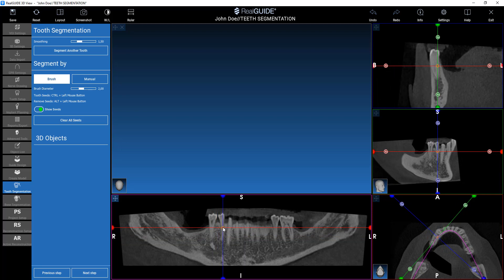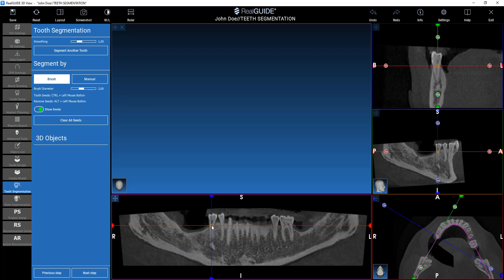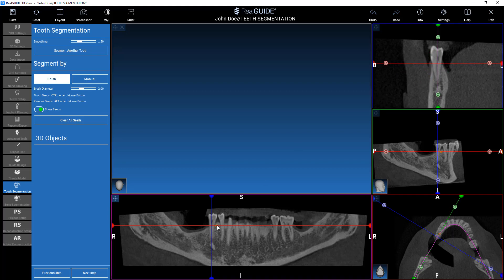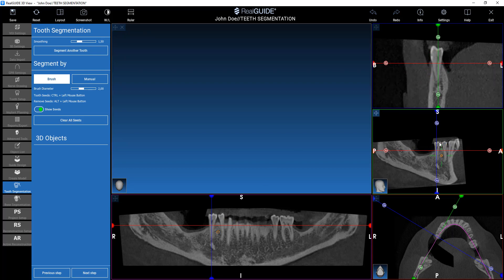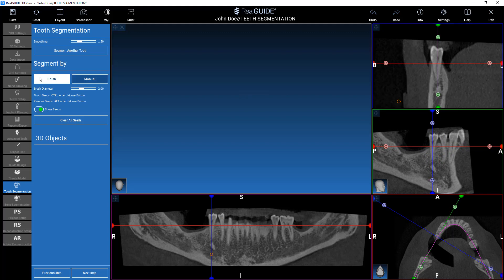The suggested operation is that we center the tooth of interest in the multiplanar images. The brush mode is already selected. We are going to outline the tooth boundary roughly first on one multiplanar image, and then eventually also on the other images.